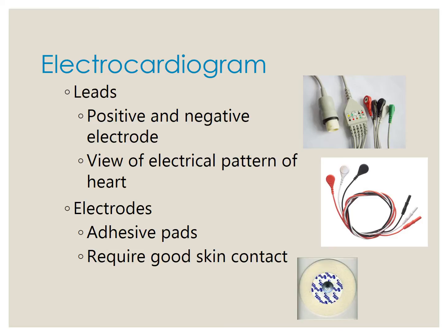These electrodes have adhesive pads that contain a conductive gel and are attached to the client's skin. So a good ECG signal requires good skin contact of those electrodes and adequate conductive jelly in the center of the electrode. You have to keep in mind that if you have somebody that has a lot of hair on their chest, or if they're dirty, you may have to actually clean the skin and clip the hair on the anterior chest to get a good adhesive going with that electrode.